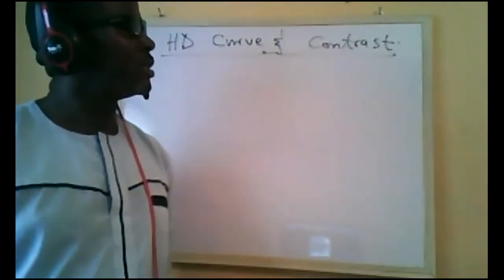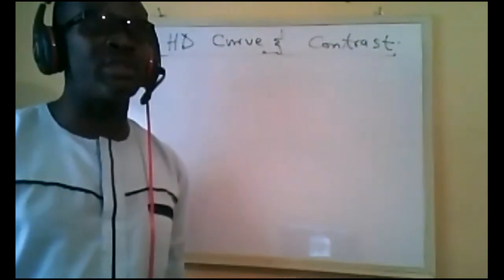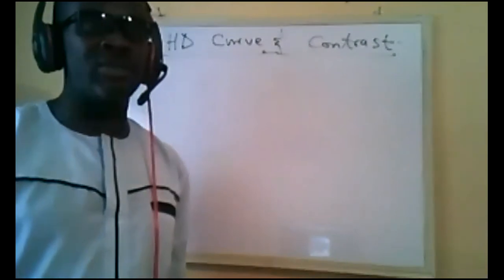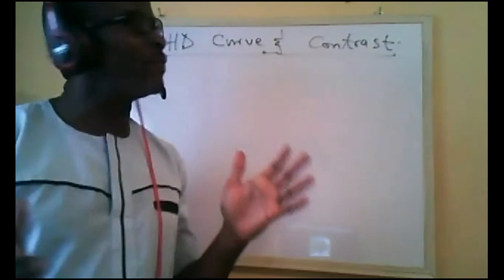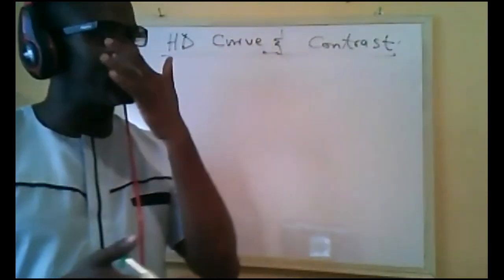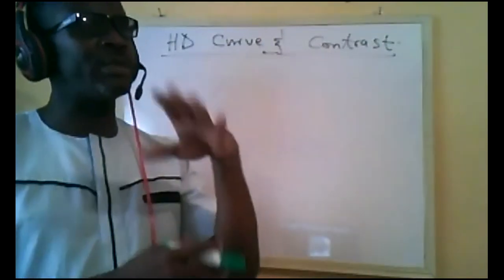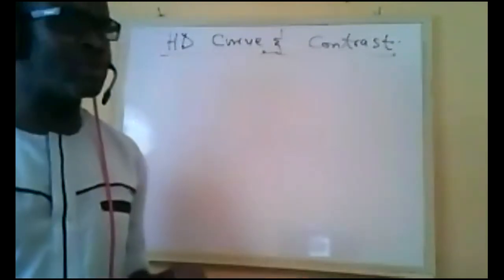Whereas speed has got to do with shift, maybe positional change along the x-axis, for contrast, it has got to do with change in the steepness of the slope. That is whether the slope is being tilted more forward or more backward.